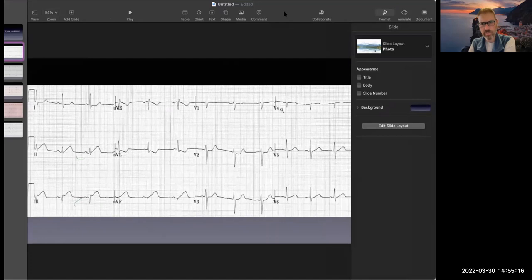And this is actually something you'd want to do if you're transporting somebody for a prolonged period of time: every 10 or 15 minutes, redo the ECG. This is called a serial ECG. And you can potentially see this evolve if this is a rapidly evolving situation.